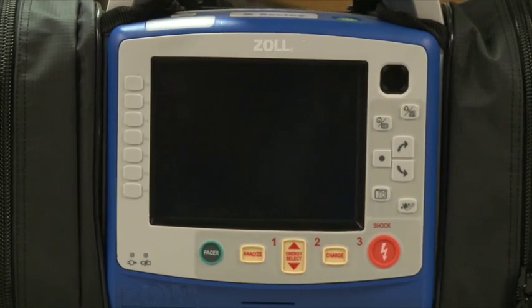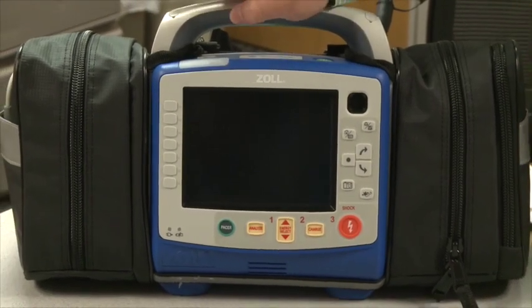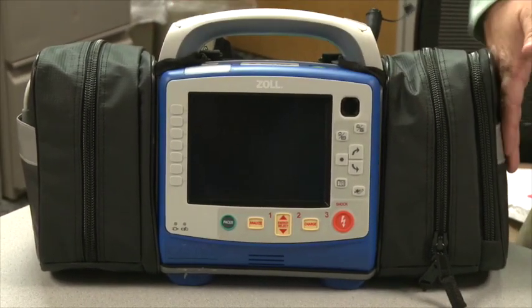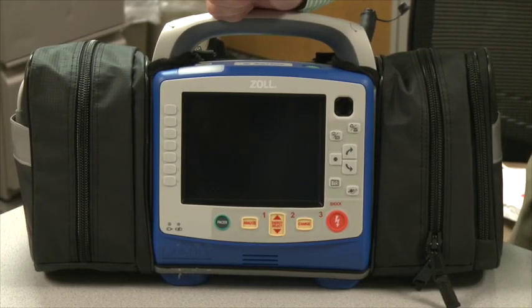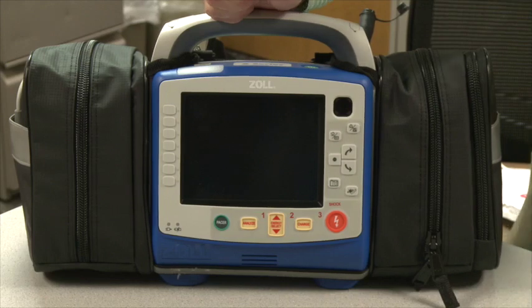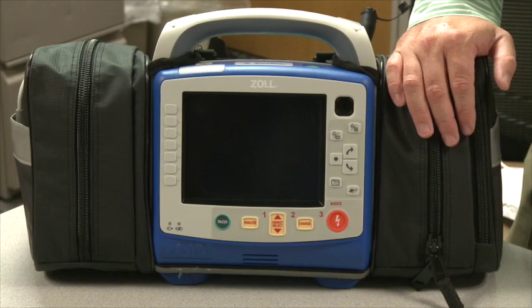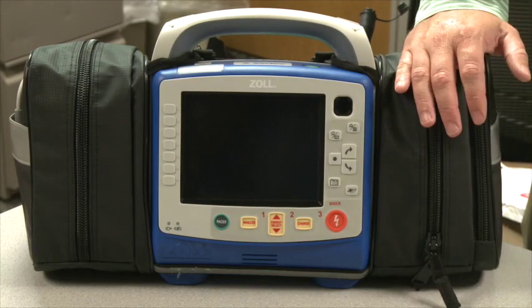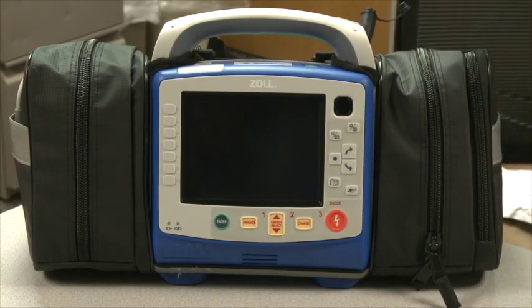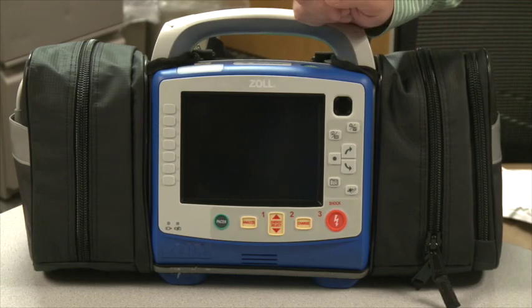The left-hand pouch contains our parameters: SpO2, 4 and 12-lead monitoring, non-invasive blood pressure, and end-tidal CO2. The right-hand pouch is our critical access side, which includes cardioversion, defibrillation, and pacing. There's also a USB port with a cell modem that allows you to transmit 12-leads — it will try to connect to the truck first as a fail-safe. That USB port also allows you to update software or download patient information into your ImageTrend charting.